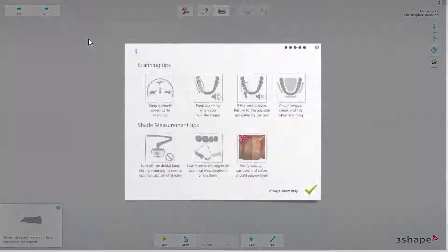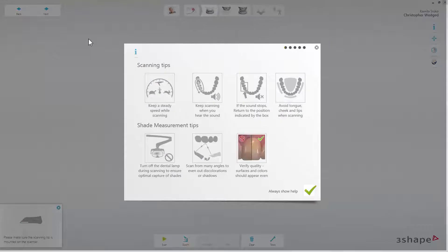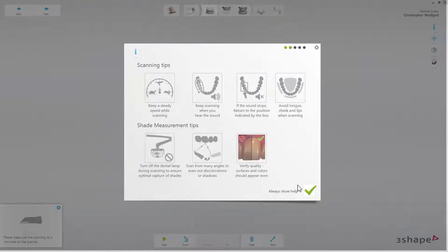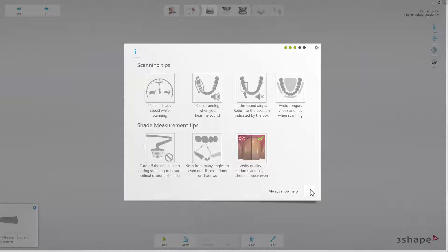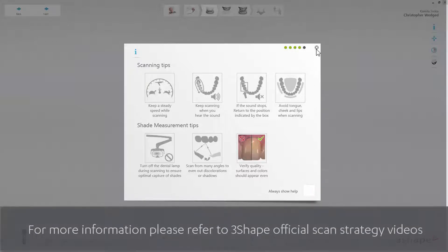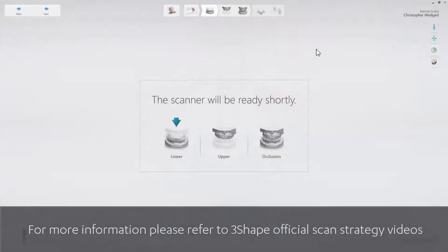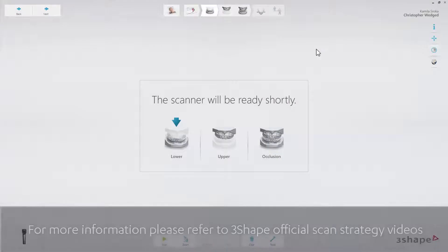When you get to the scan page for the first time a pop-up with scanning tips will appear. Please read and follow the tips on this page to ease the scan experience. You can deselect Always Show Help in the bottom right corner. For more information, please refer to 3Shape's official scan strategy videos.